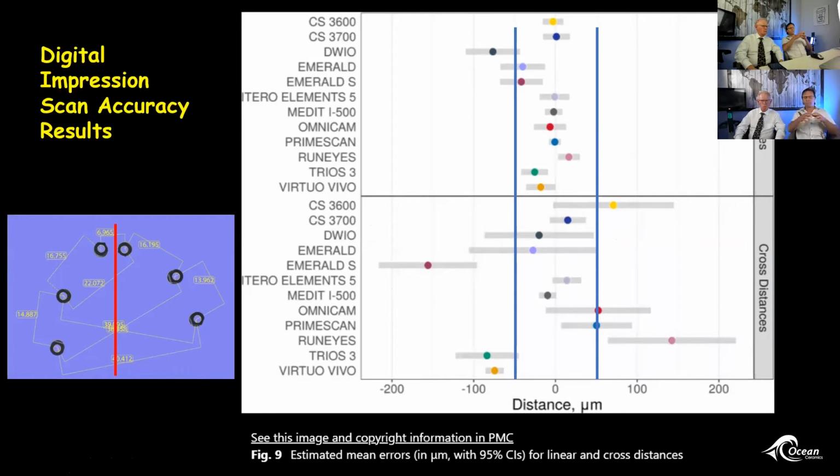And what means a lot to me too is it answers a lot of questions when we have had questionable fits with full arches sometimes, not single units. When we try to do hybrids digitally, it's very, very subjective sometimes, unless you're picking up abutments in the mouth. So when we're doing hybrids, we always advocate PVS impressions for this very reason. But the market's wide open with accuracy for quadrant scanning. We really want to take a close evaluation of scanners with cross-arch scanning ability.